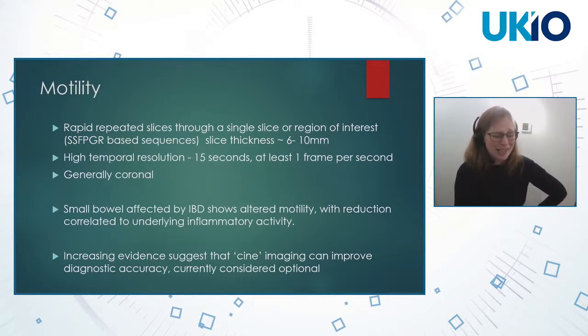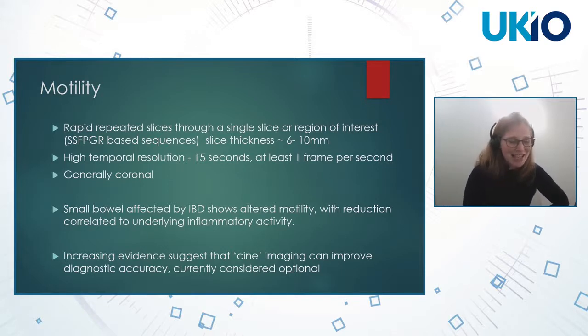The reason we do this is there is evidence that motility changes with bowel activity, and that if the bowel is actively inflamed, it has reduced motility.